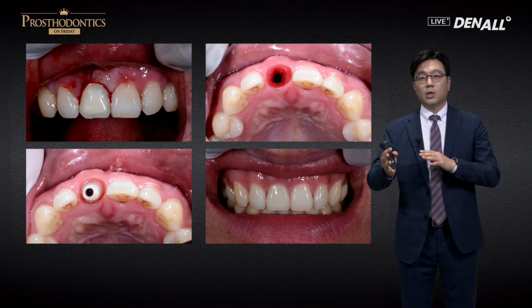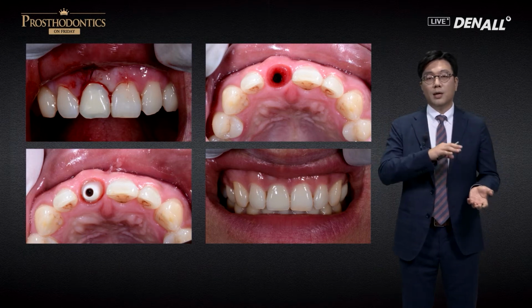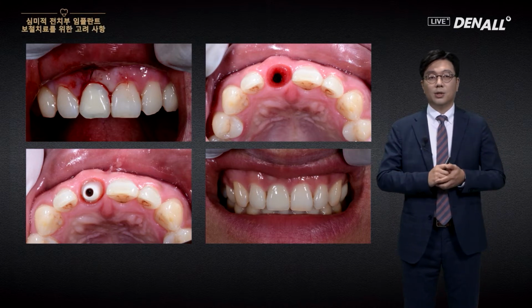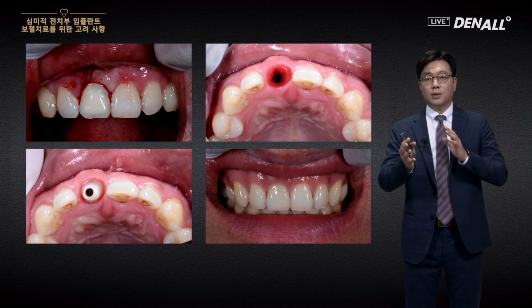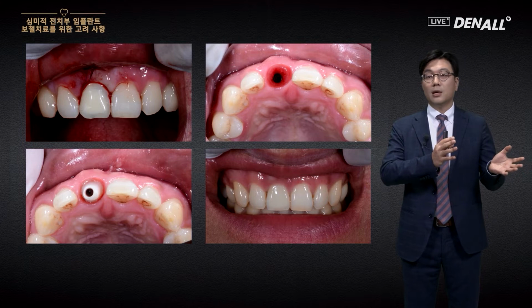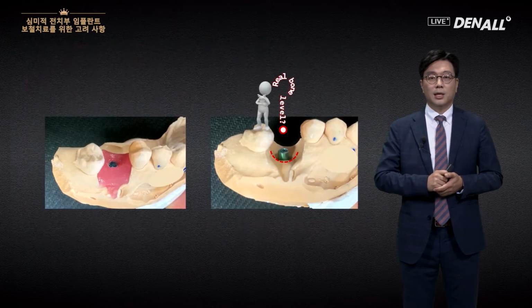Sometimes when the stability is good, on the day of the placement, temporary abutment and artificial tooth can be delivered. Composite resin is used to adjust the form. And at the beginning, we don't need to communicate a lot with the lab. Communication is required at a later stage.